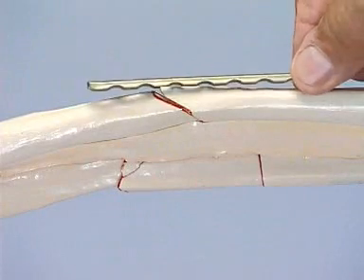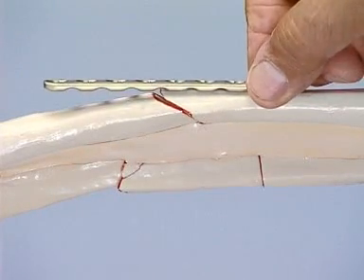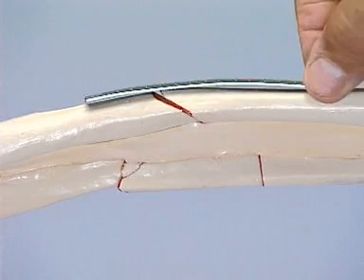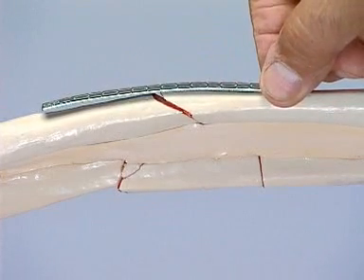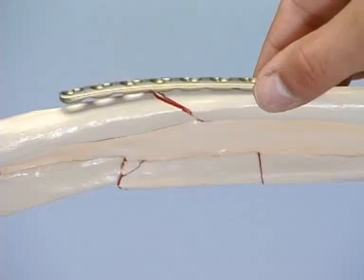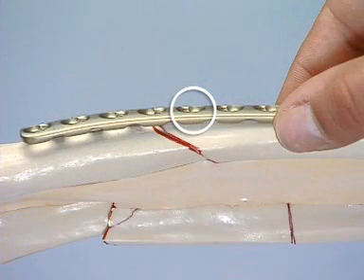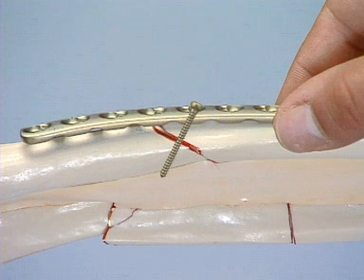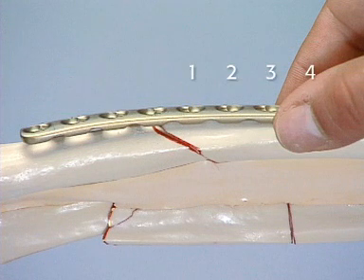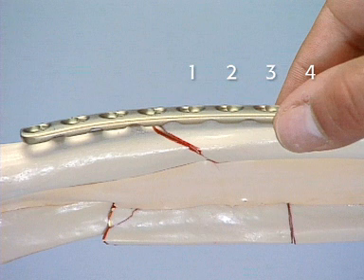The radius is slightly curved, so the plate must be contoured. The bending template helps to obtain the correct curvature. Choosing an 8-hole LCP requires that the appropriate plate hole already be selected for the interfragmentary lag screw that will be inserted across the oblique fracture. Three holes will lie over the proximal fragment and four over the distal fragment, with one hole left free for the lag screw.